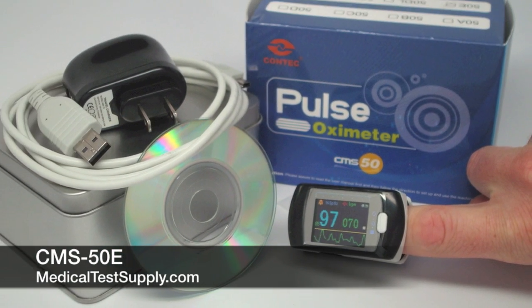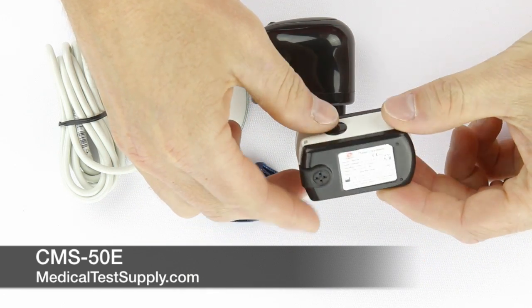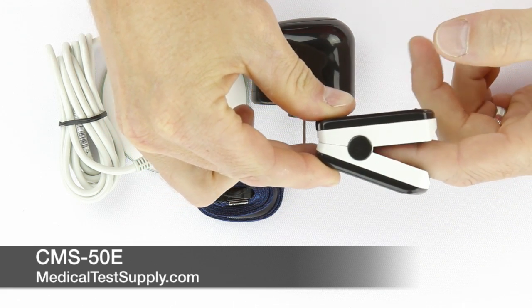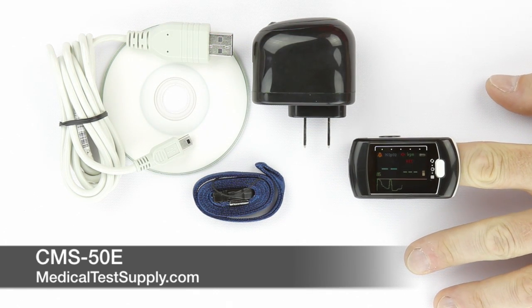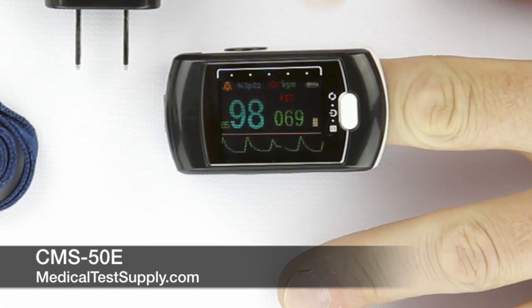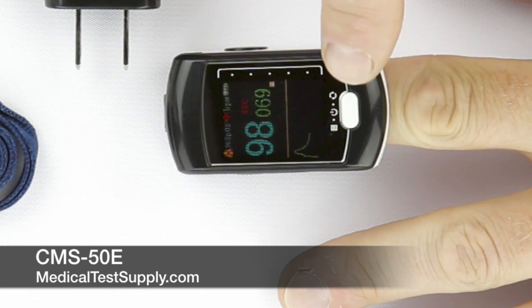Now I would like to illustrate our feature-rich CMS-50E fingertip oximeter. This device is much like the CMS-50D Plus and has a 24-hour memory that is uploadable to a PC. The device comes with software that allows for analysis of stored oximetry data and has the capacity of generating trending information that many patients require. The device displays oxygen saturation, pulse rate, and a bar graph illustrating pulse strength. A small light will appear in the right corner when the device is in recording mode.